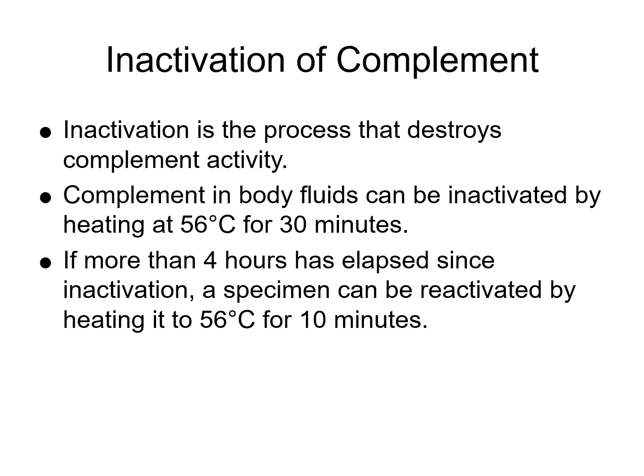For the best practices, we can use a calibrated water bath or heating block to maintain that 56 degrees Celsius precisely. We want to, again, make sure we label our specimens clearly with inactivation time and date. We're going to follow those procedure-specific protocols regarding the inactivation to maintain the test accuracy.